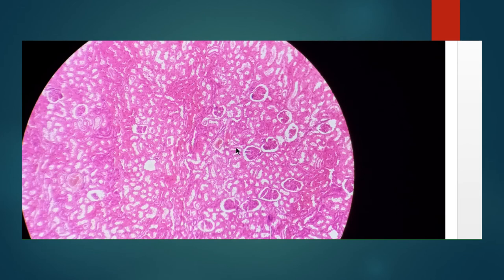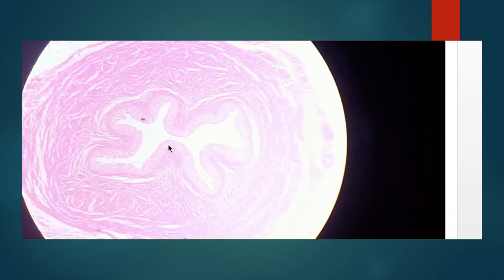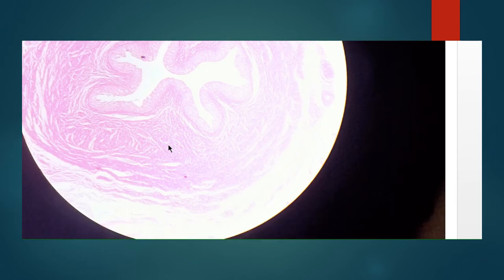Here also you can identify the kidney. These are all the points to identify the kidney. Now, moving to the next part. After the kidney, we can identify the ureter.